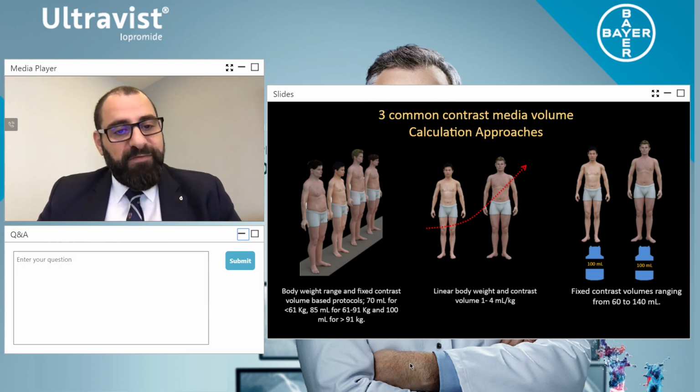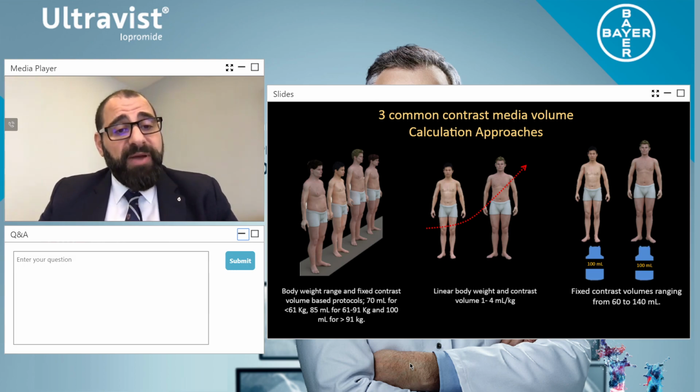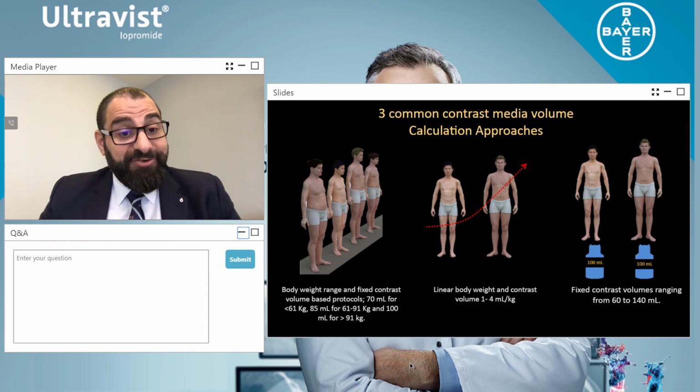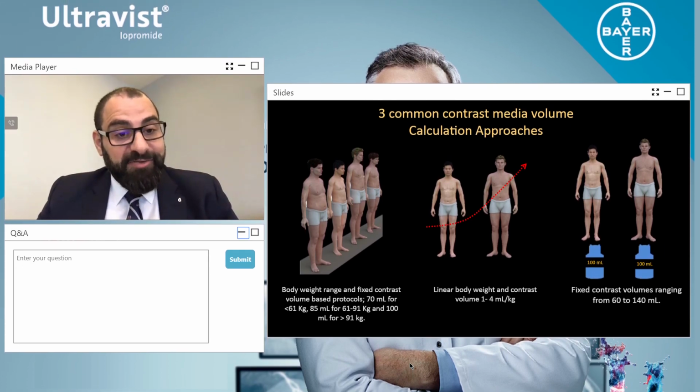So in actual fact, what I would recommend is we use a dual barrel or double barrel for every injection that you do. One, make sure your patient is well hydrated before they come to the examination. Two, I always use a 100 ml saline flush, which we're going to talk about in a minute. And three, by doing this, we're actually keeping the patient safe. The new guidelines now are going more towards patient hydration status than anything else.